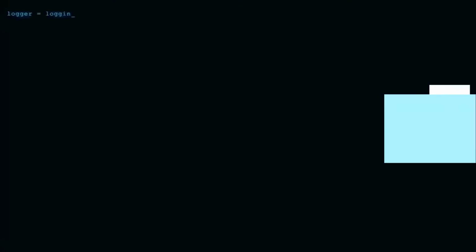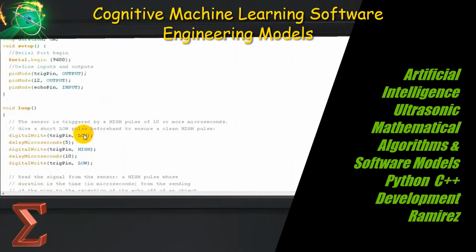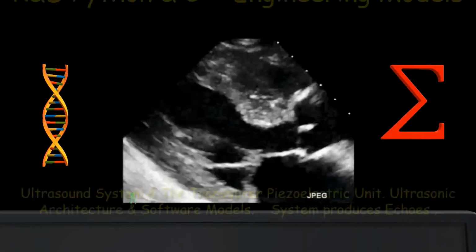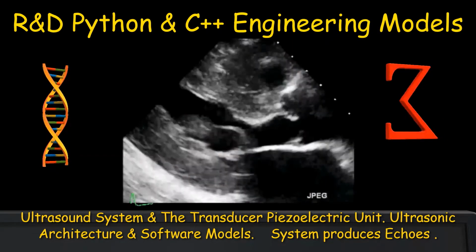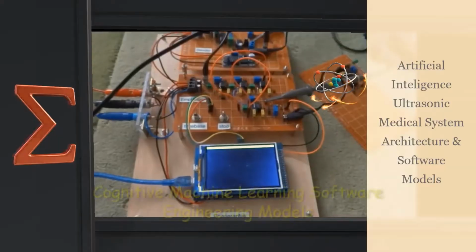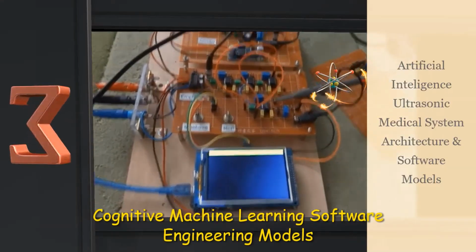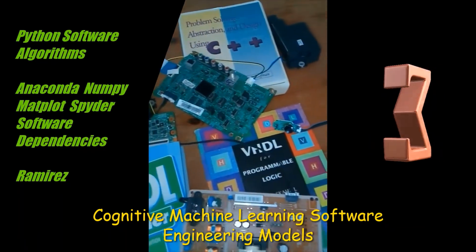The transducer pulsar subsystem provides a precise high voltage pulse necessary to excite the sensors while remaining robust enough to be controlled by the neuromorphic architecture and CPU system.